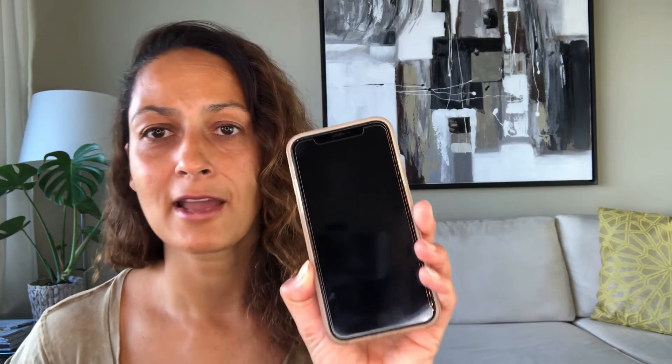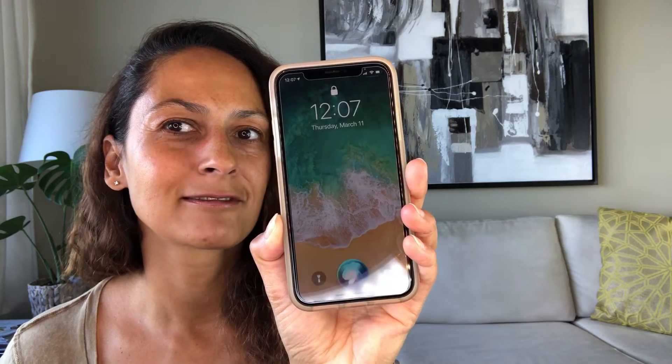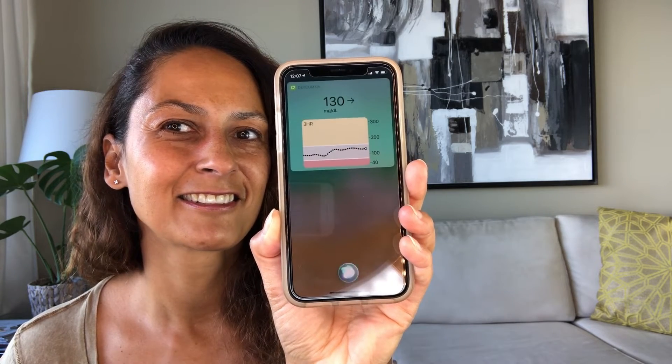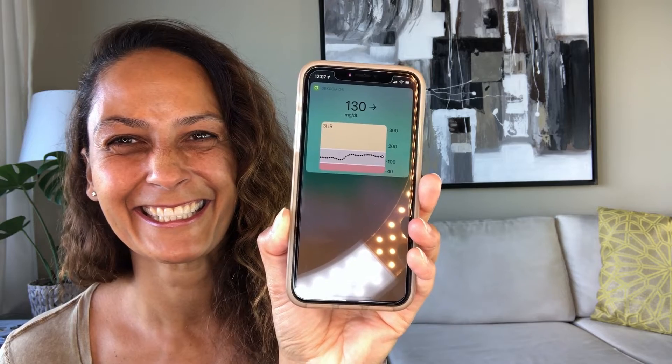I am Christelle from Diabetes Strong and in this video I'm going to show you how easy it is to get the Siri Dexcom G6 CGM shortcut directly on your phone. When you do, you can do this — hey Siri, what's my glucose? Okay, viewing, you're 130 and steady. I think that's a super cool functionality — it's kind of fun but it's also really practical.